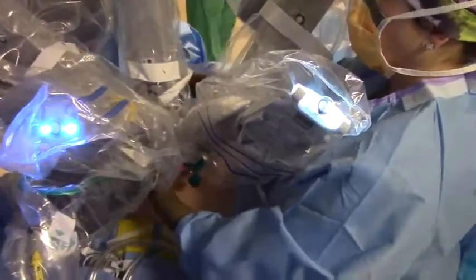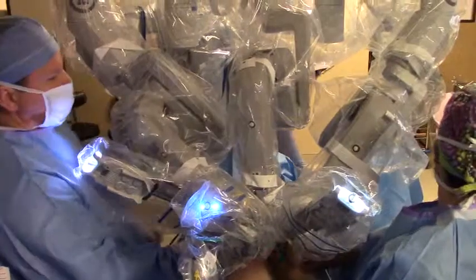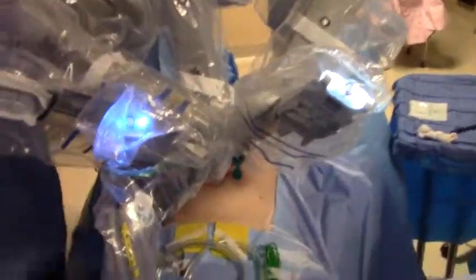We're good. Alright, Bert — I'm ready. One, two, three, press. And here we go. And that should do it. We'll just hit the left side of the sweet spot.